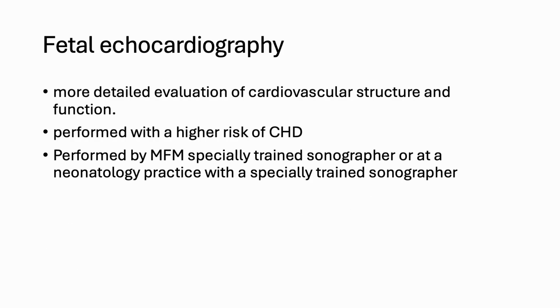So the last thing we'll talk about with different ultrasounds is the fetal echocardiography. This is done when either a prior baby had a history of cardiac disease, or the maternal history or family history has a concern for congenital cardiovascular disease.